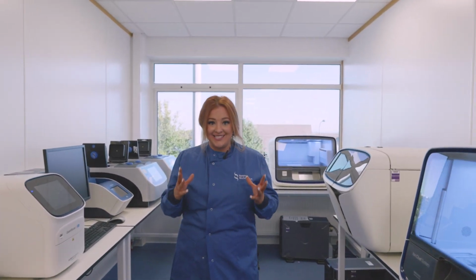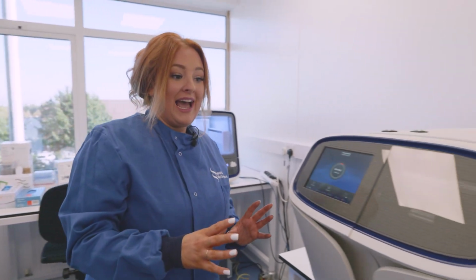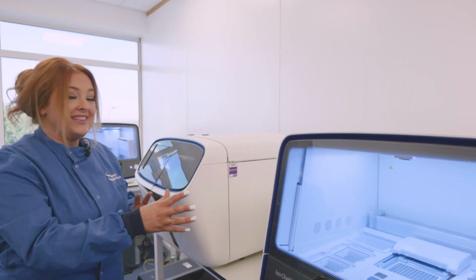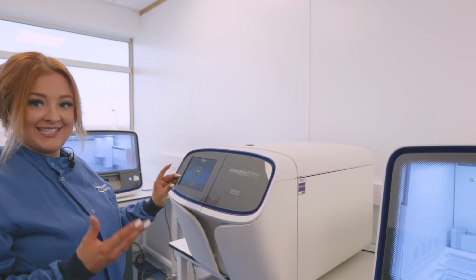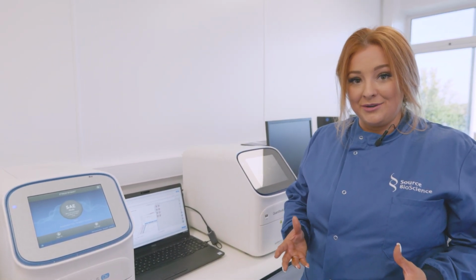So this is our instrument and staging area. So this obviously has a lot going on in here. We've got our PCR machine. So this is a tetrad, so we can process multiple plates on here. Then we have our Thermo Fisher NGS sequencing package here. So we've got our Ion Chef that does the templating, and then these talk to each other. So once the chips are loaded, these then get loaded into here and the sequencing occurs. We can also carry out qPCR. Here we use QuantStudio 5s. This in particular we use for our EndoPredict testing, but we do offer other clinical tests as well.